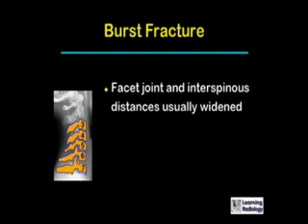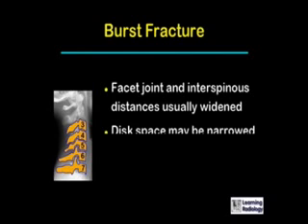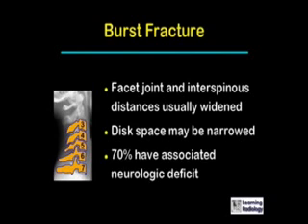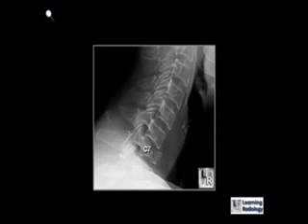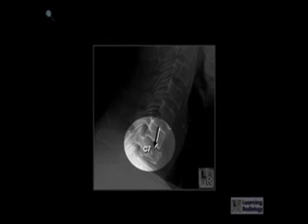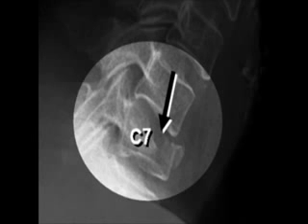In burst fractures the facet joint and interspinous distances are usually widened, the disc space can be narrowed, and seventy percent have associated neurologic deficits. This is an example of a burst fracture of C7. The black arrow points to the vertical fracture through the anterior aspect of the body of C7, with marked compression of the anterior aspect and the posterior aspect of C7 pushed backwards into the spinal canal.